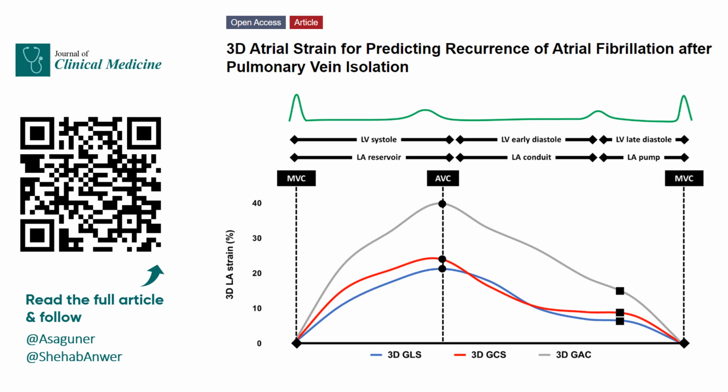Regarding the methods and results of this study, the 3D longitudinal atrial strain and the two-dimensional strain were measured, as well as the low voltage map was calculated in 93 consecutive patients who underwent pulmonary vein isolation, and we analyzed the association of these parameters with the recurrence of atrial fibrillation after the blanking period has passed. Unfortunately, 12 patients experienced atrial fibrillation after that period.